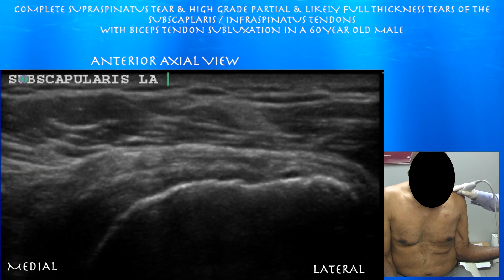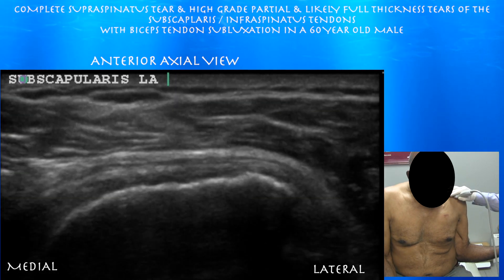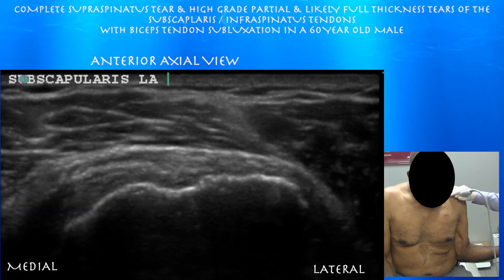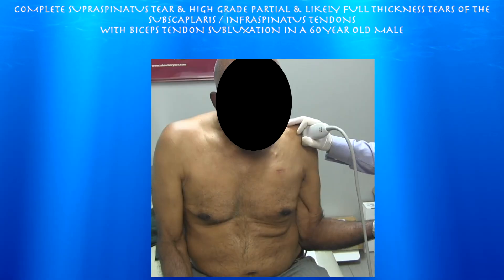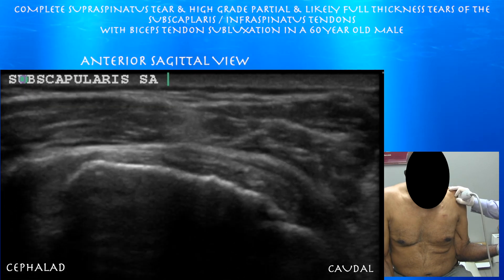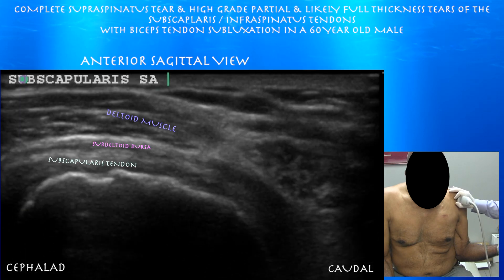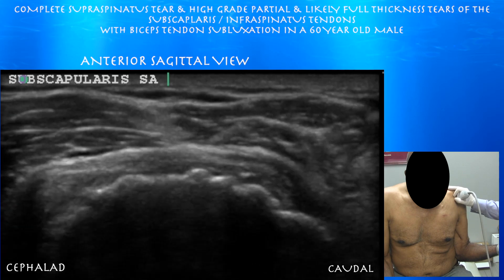Scrolling through now — it looks like he does have a full thickness tear in this region, as we really don't see much of a subscapularis tendon attaching to the lesser tuberosity. In these sequences you really can't make out much of a subscapularis tendon. Now looking at it in short axis. You're seeing a very thin layer of compact fibrillar structure above the bone, so he does have some tendon left, but it's a pretty high grade or full thickness tear of much of the tendon.